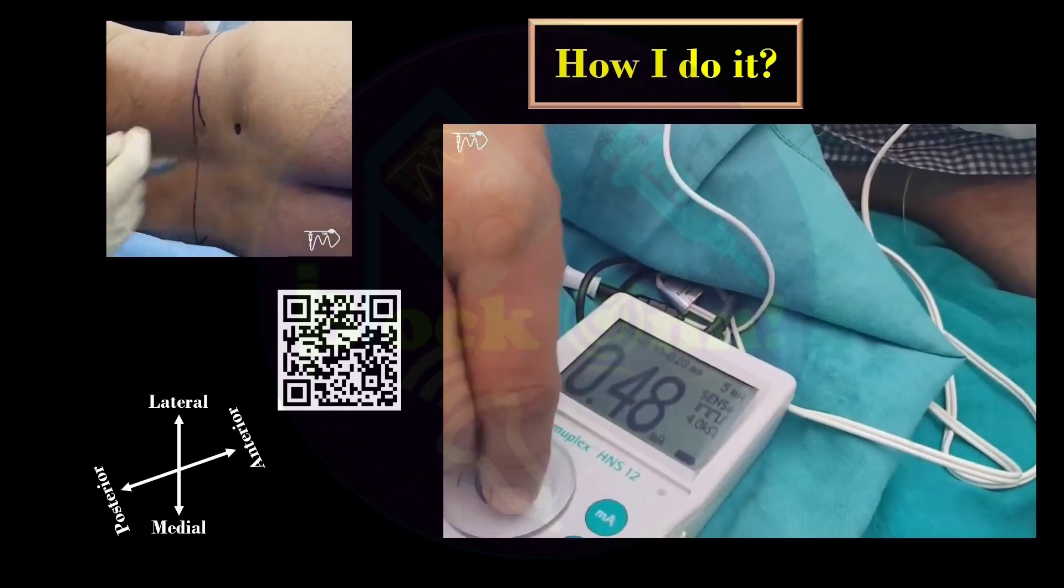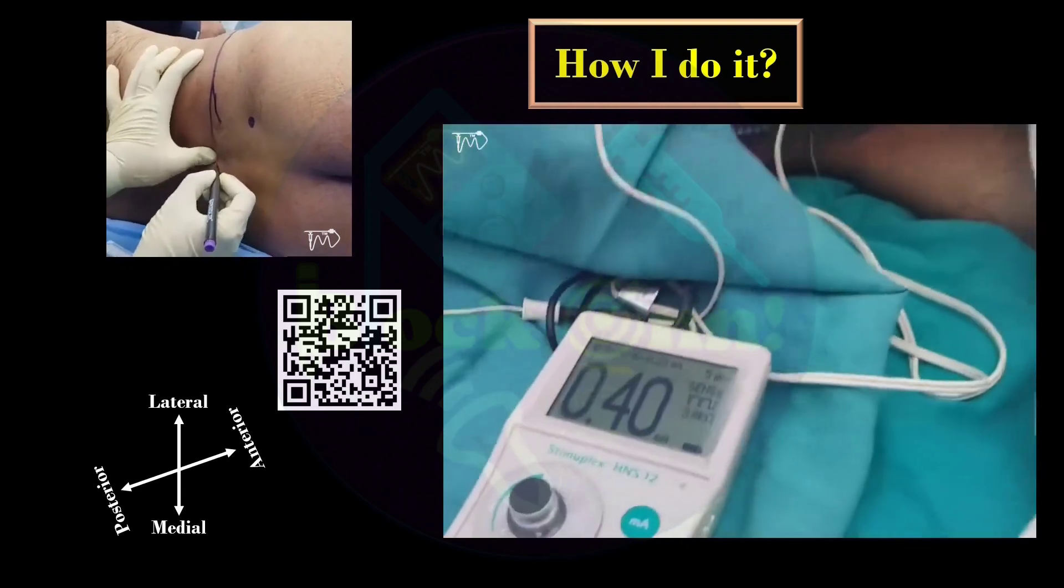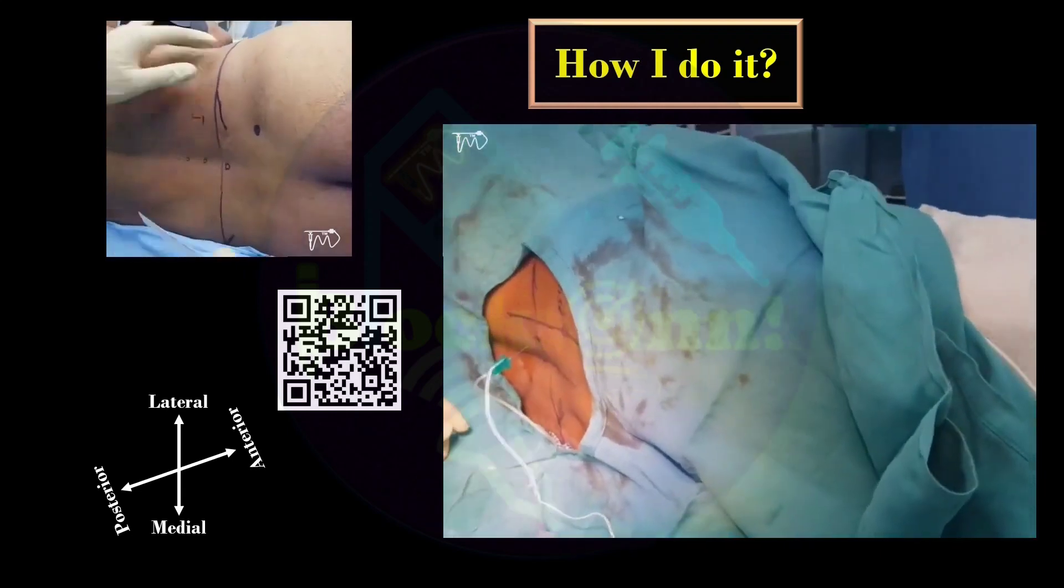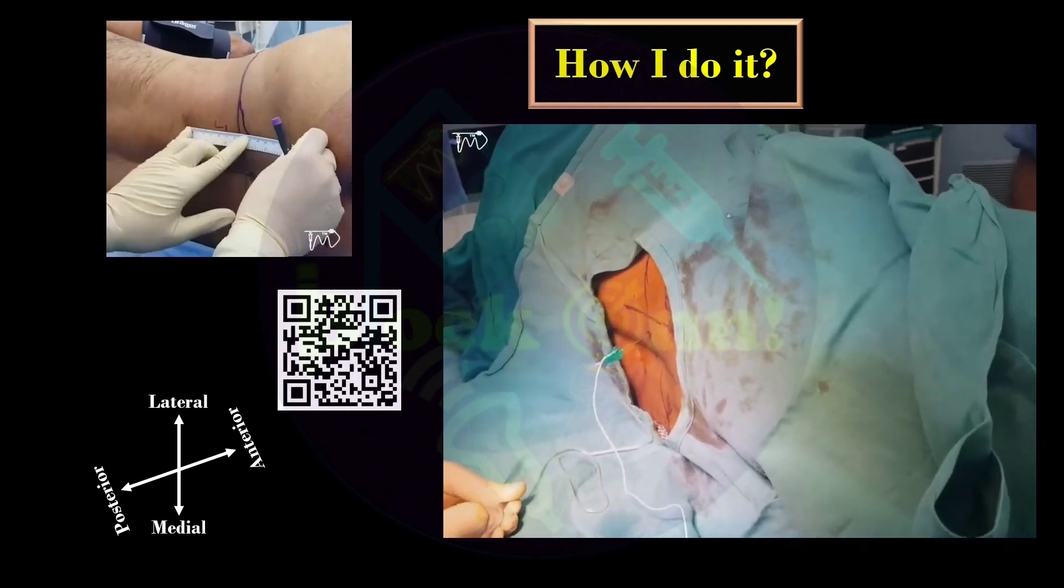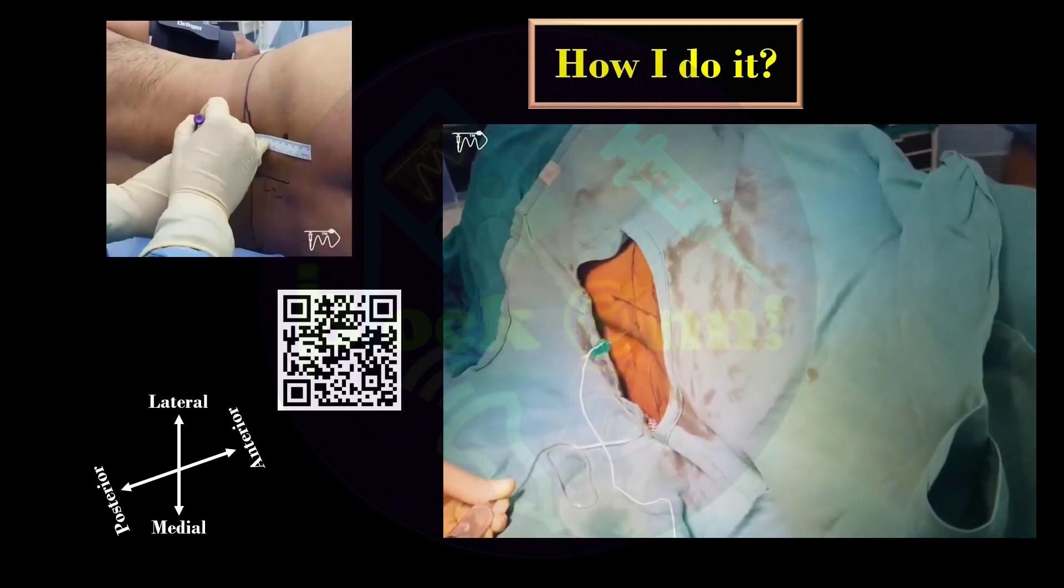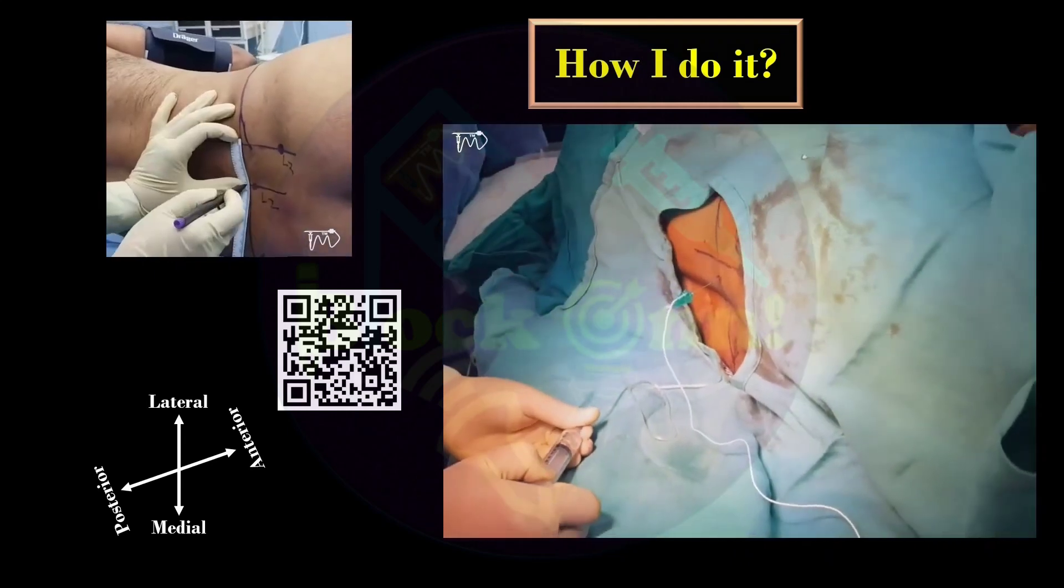You should not get any response beyond 0.4, because if you are getting response below 0.4, that is 0.2 or 0.1, that means you are very close to the dural sleeves. Injection here would lead to total spinal or epidural anesthesia. Be careful about that.